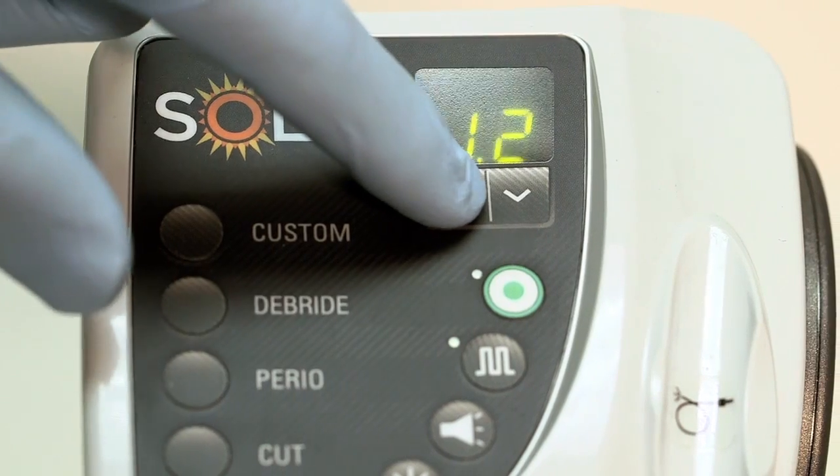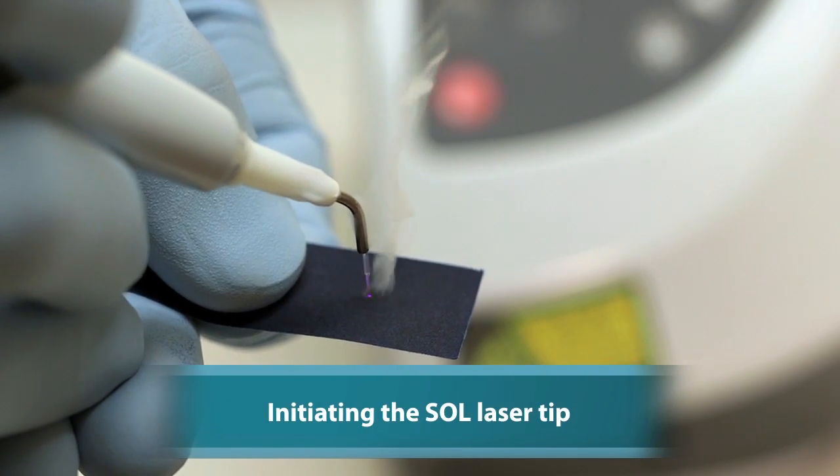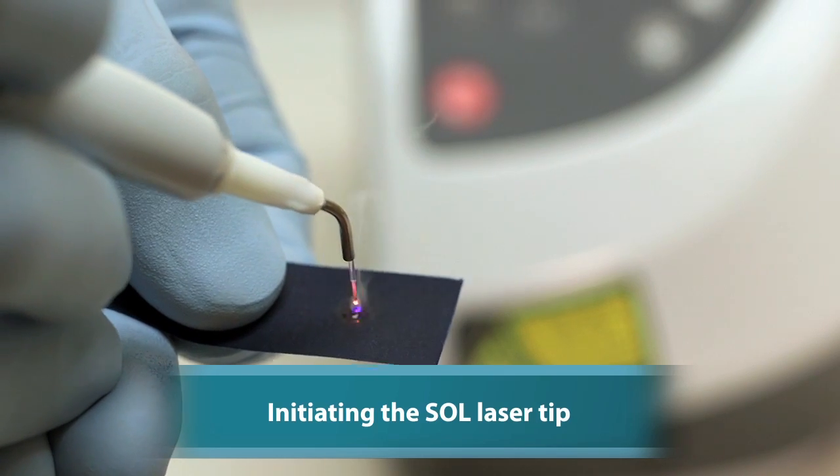The whole procedure just moves along faster, and the patient feels better more quickly, so the healing is better. If there are any other procedures to be done — for example, a little gingivectomy to recontour one little part of the gingival outline — I could do that right then and there, and it doesn't add any difficulty to the procedure at all.